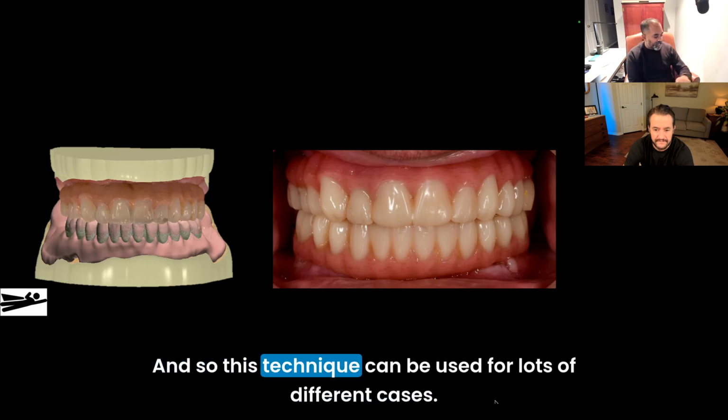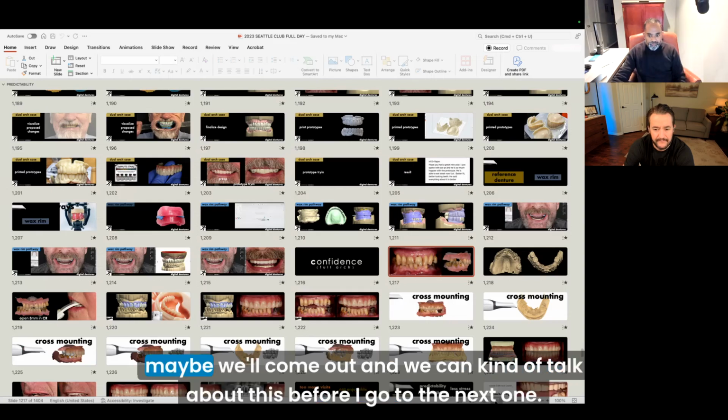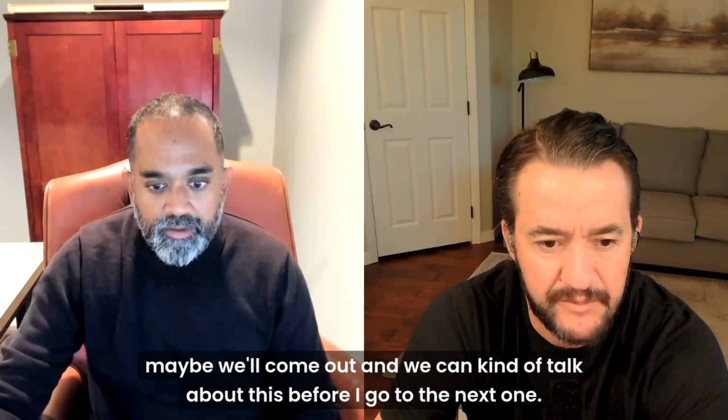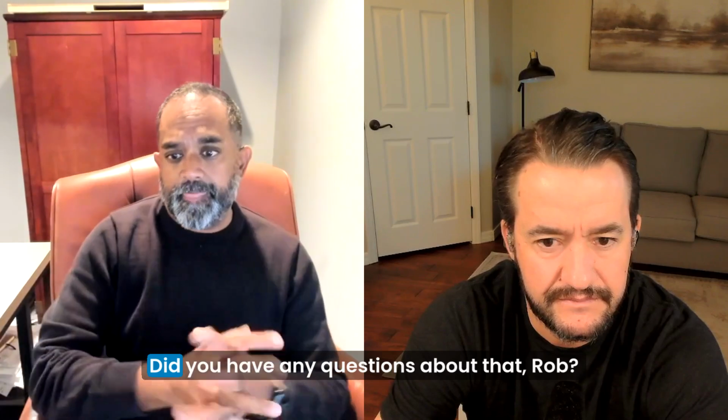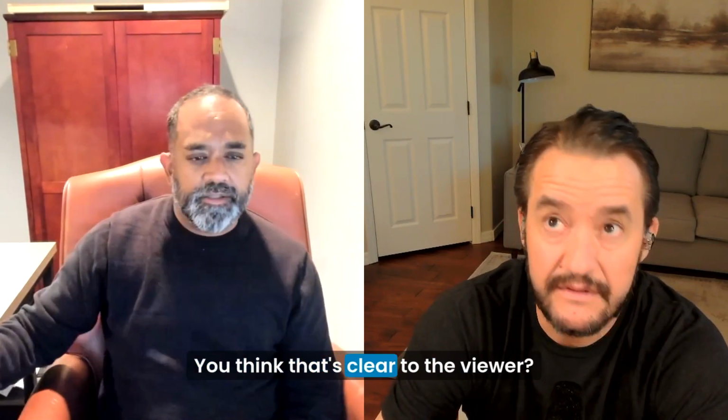And so this technique can be used for lots of different cases. And so that's actually one way to sort of do it. And maybe we'll come out and we can kind of talk about this before I go to the next one. Did you have any questions about that, Rob? You think that's clear to the viewer?